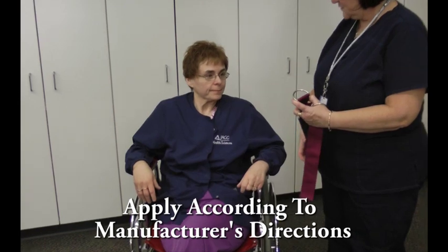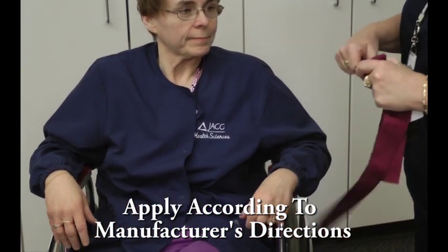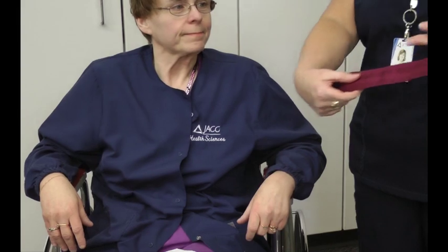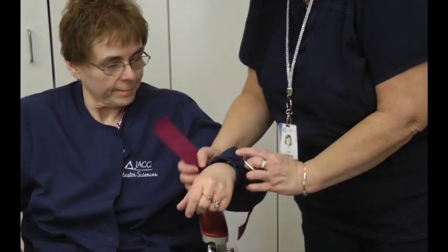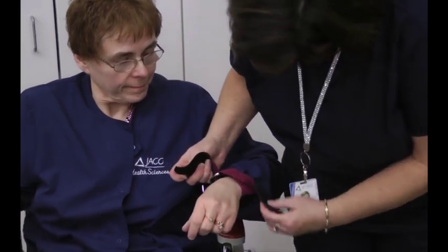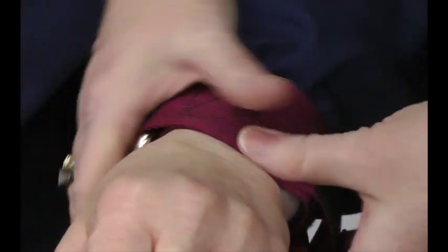These are wrist restraints. Now, we're just putting them on for pretend, but I do want to demonstrate how these work, okay? Alrighty. Okay. So, the very first thing is you're going to want to hold them out. The wrist goes through here, okay? You're going to want to move your arm back just a little bit, see if you can get it around here. We're going to put the Velcro on.